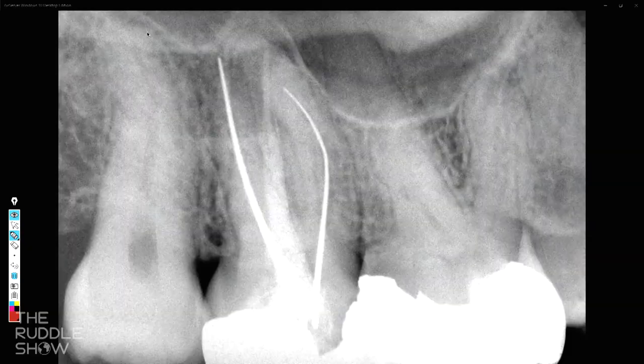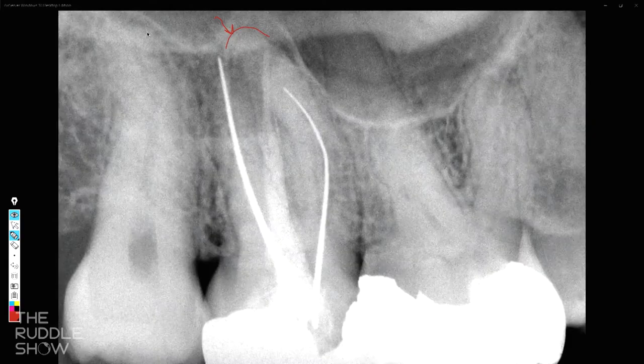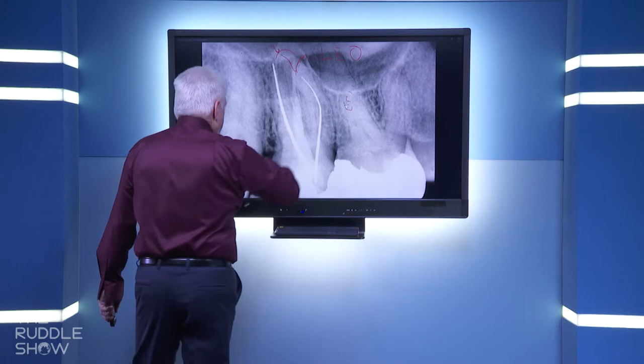The lesion, here's the radiographic apex. I'm reading the radiographic apex is right here. It's kind of like that. But the canal comes up and ends over here. And we know that because that's where the lesion of endodontic origin is. It's over on the side. So we expect this to actually go up, could bifurcate, but probably it's going to come over like this. And then we've got to do a little bit more work in the DB.